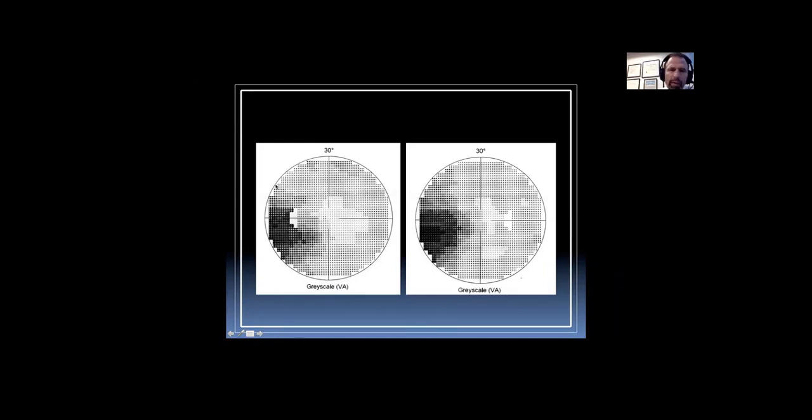So this is a homonymous hemianopsia, and I don't think I have a question. So this is a lateral geniculate body field defect. And this is a lateral choroidal artery infarct that gives you this wedge look. At the bottom, I say an anterior choroidal artery infarct gives the opposite.